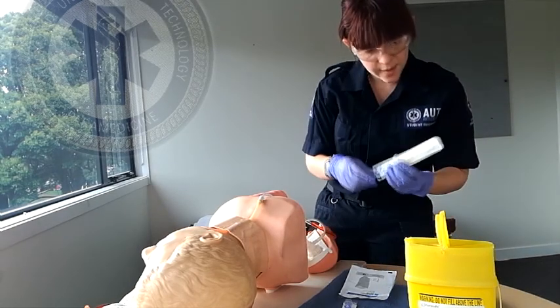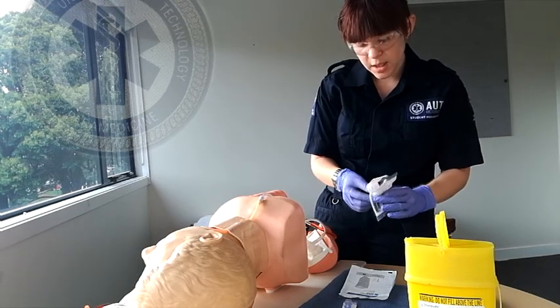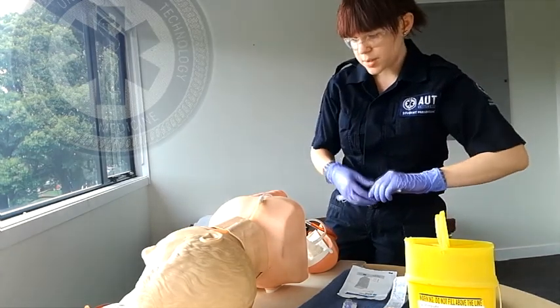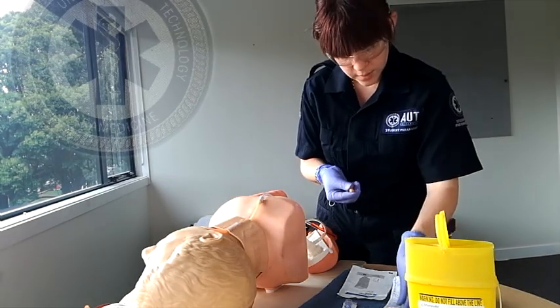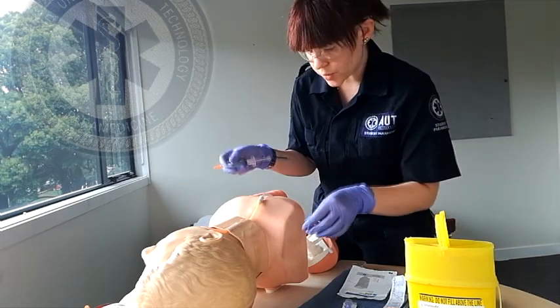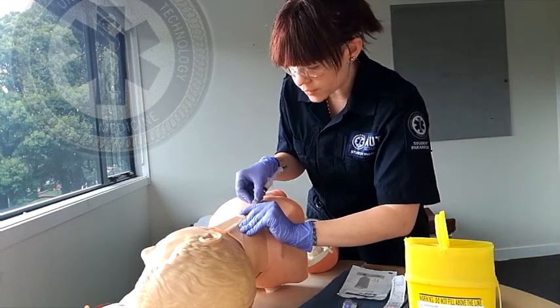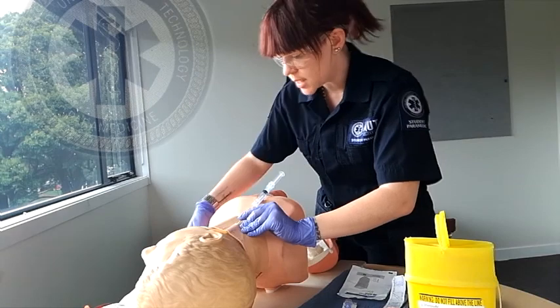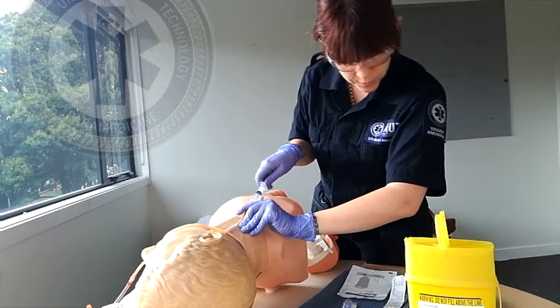I have this cannula drawn up already with the syringe attached and the saline has been drug checked by an off-sider. I'm going to go ahead with this now — you'll just feel a sharp scratch. Using a 14-gauge cannula, you want to enter at a 30-degree angle, going straight into that jugular vein. You want to make sure you have entered the vein, and a good way of doing that is to check for drawback, or flashback as it's called.